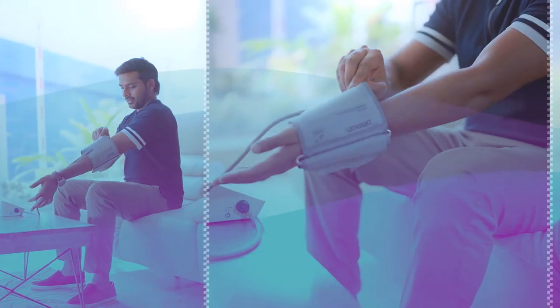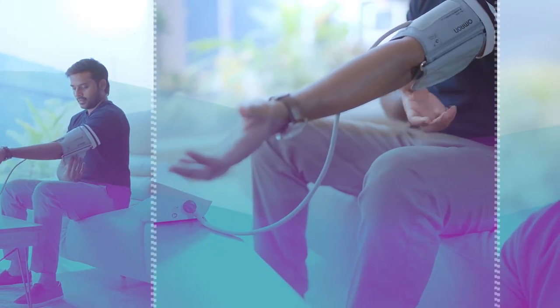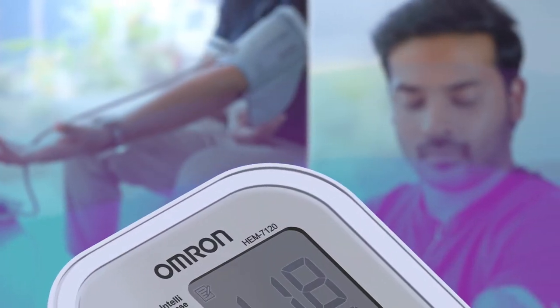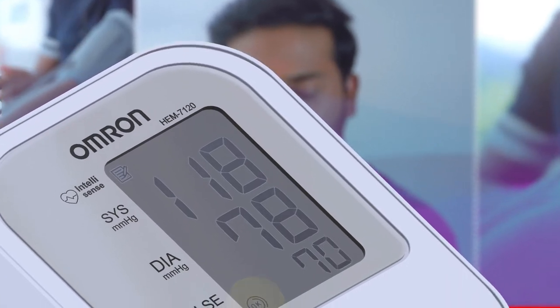Stay relaxed and wear it on your upper left arm. The Cuff Wrapping Guide, which is an Omron exclusive feature, will let you know if the cuff is placed properly by showing the OK symbol.